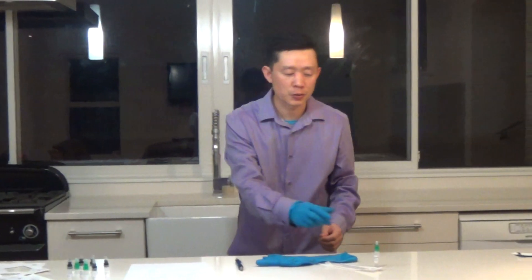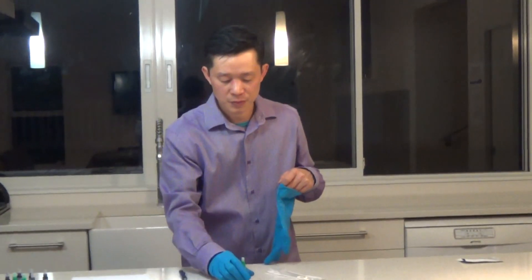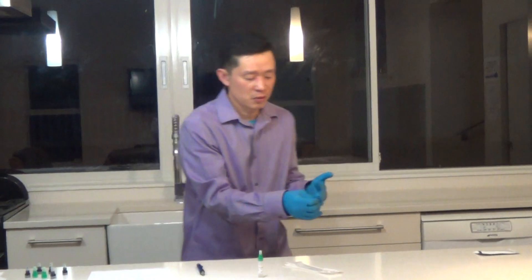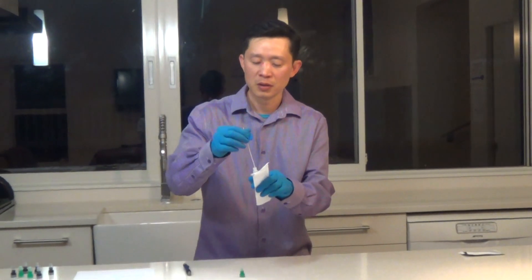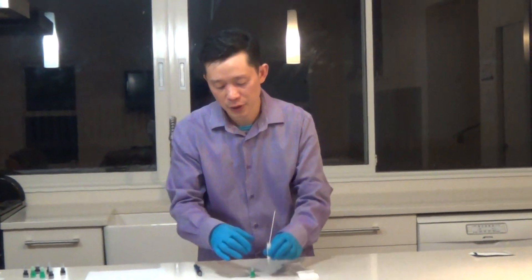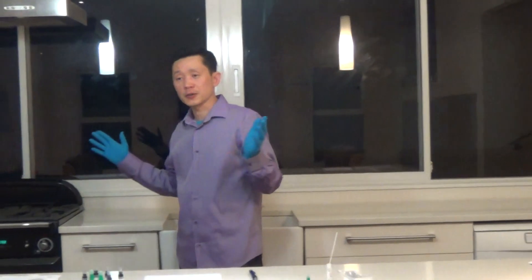The recommendation from the manufacturer is to shake this buffer liquid for around 30 seconds before you use it. After that, we're going to insert this sterilized swab into the buffer. Now we'll open the cup and insert this inside it. The recommendation is around 30 seconds, but while it's in there, we're going to show you what's a good area to swab in a house.